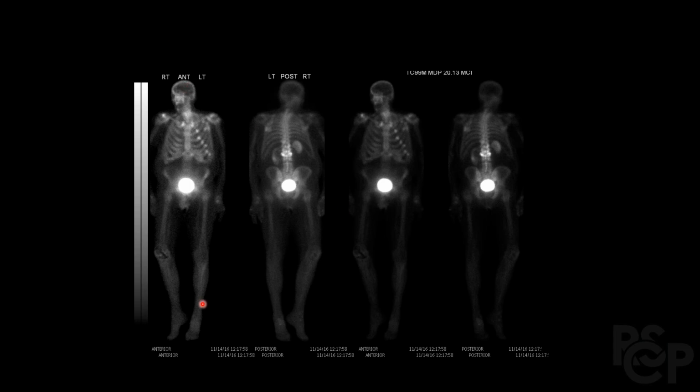Okay, so we can start from top to bottom again. The skull seems to be looking okay. There's increased uptake in the sinuses. This can be a very common finding, and you can confirm that by looking at the posterior side.